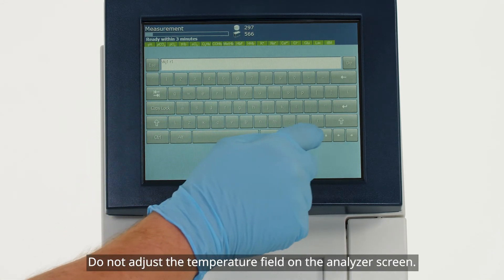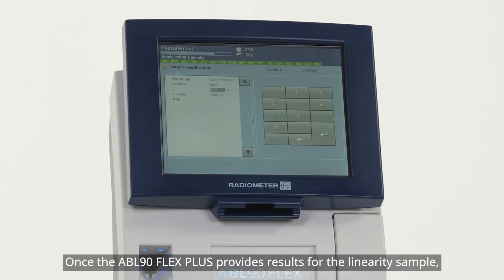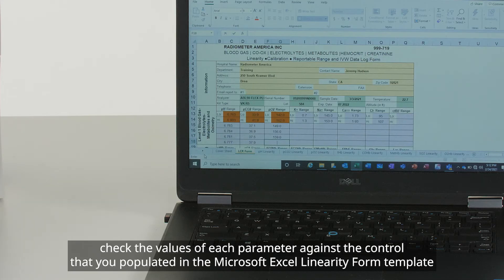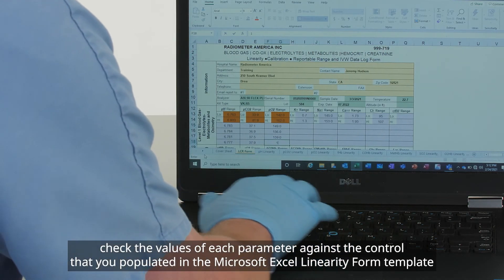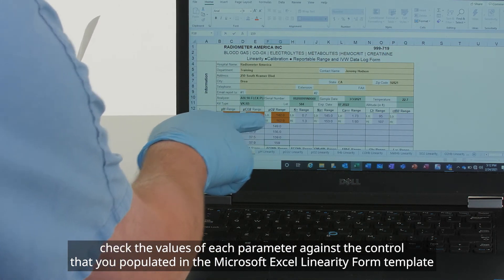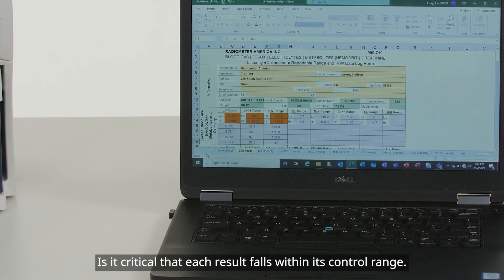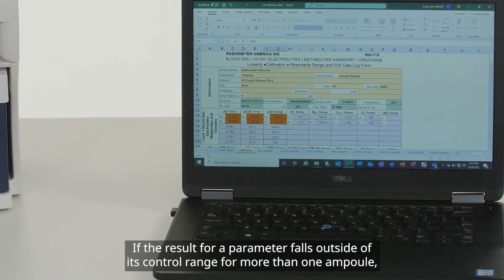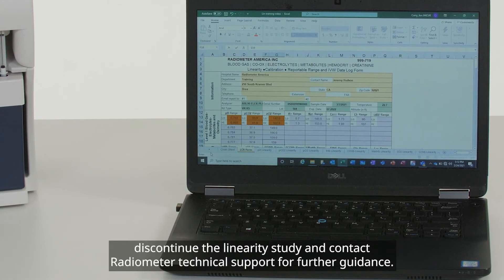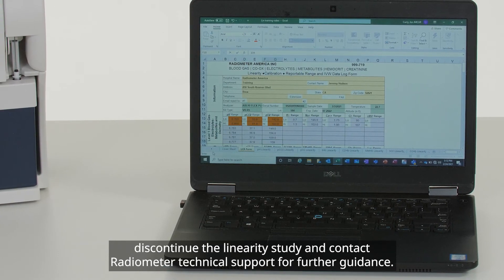Do not adjust the temperature field on the analyzer screen. Once the ABL-90 Flex Plus provides results for the linearity sample, check the values of each parameter against the control that you populated in the Microsoft Excel Linearity Form template. It is critical that each result falls within its control range. If the result for a parameter falls outside of its control range from more than one ampoule, discontinue the linearity study and contact Radiometer Technical Support for further guidance.